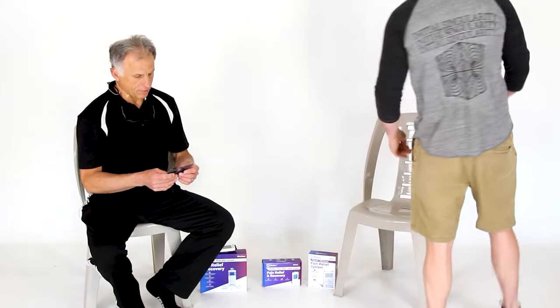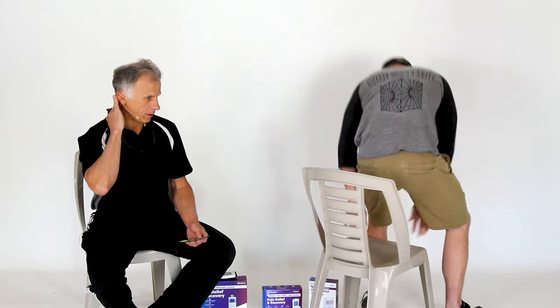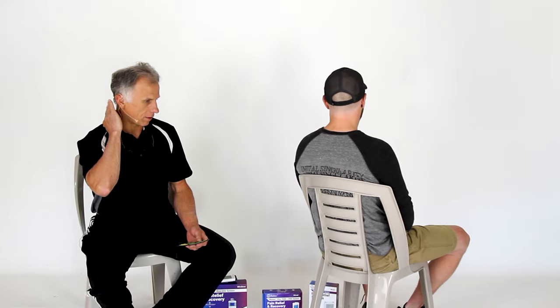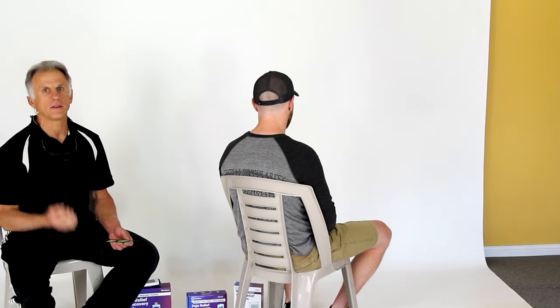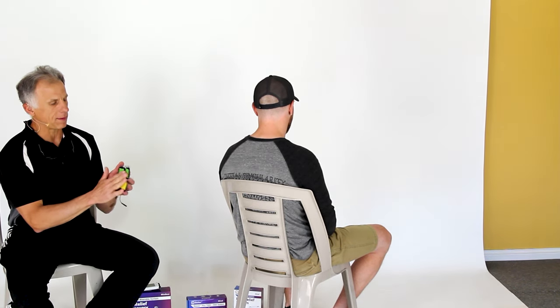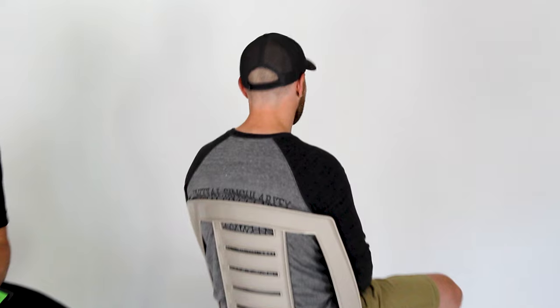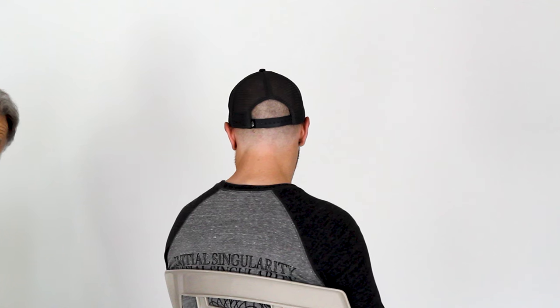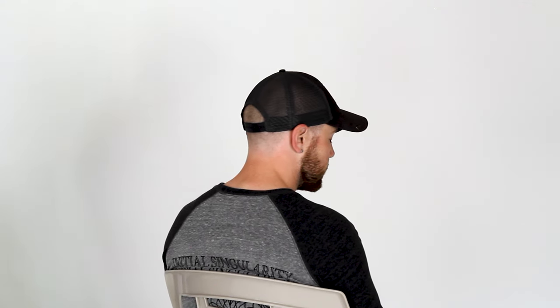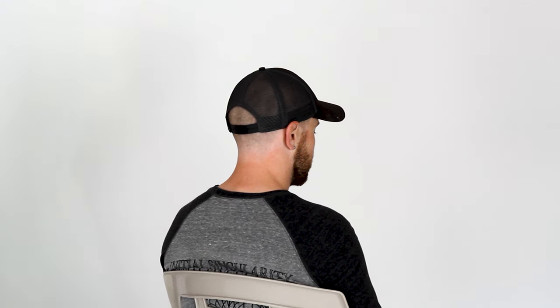One thing I want to mention particularly with the neck: because of COVID-19, I haven't had a haircut in a few weeks and I've got hair growing down the neck. If the area is too hairy, the pads will not make good contact — they don't last very long and can be uncomfortable. You may also want to put soap and water on the area first, because the oils from your skin can break down the pads. Wash it up good, dry it good — makes the pads last much longer.